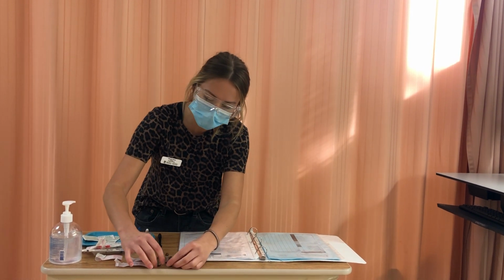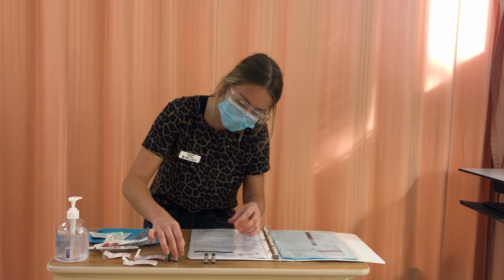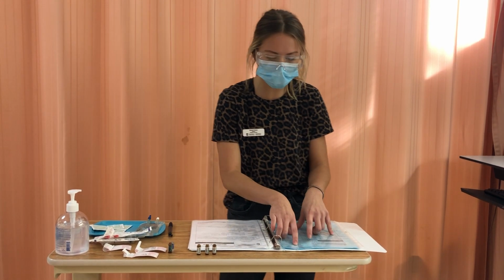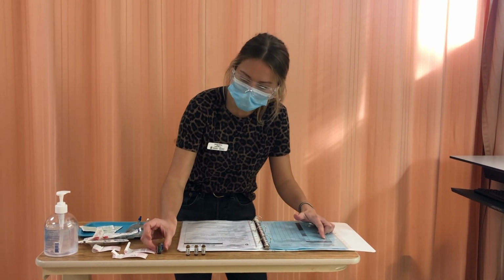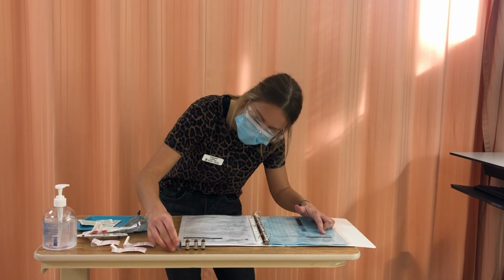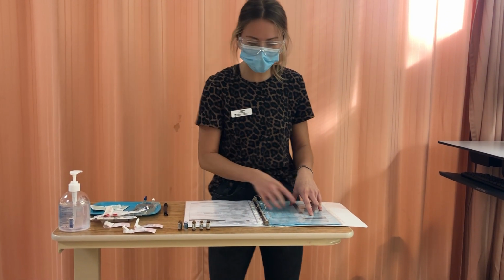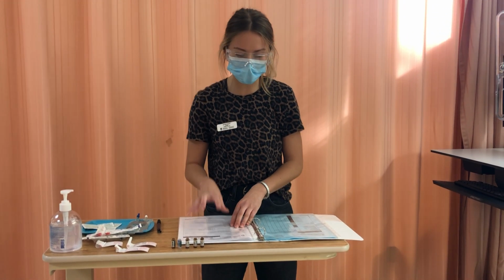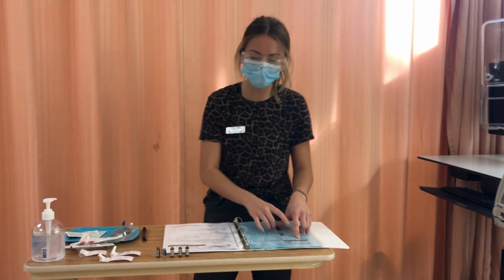So I have 5 10 milligram per ml ampules here. So my right patient is Marcy, my right medication is morphine sulfate. So I have morphine and I have checked morphine. So that looks good, right drug. I reviewed the monograph for this high alert medication. The right concentration they want is 1 milligram per ml.